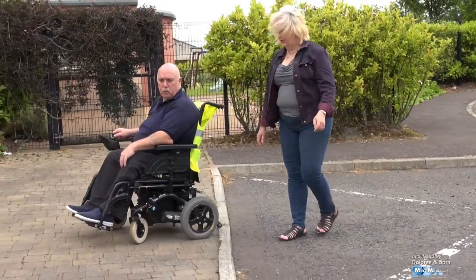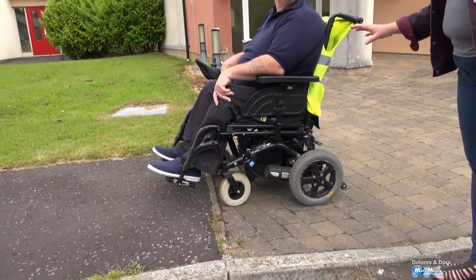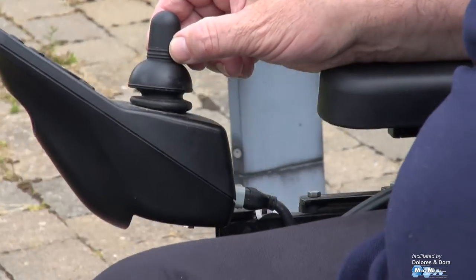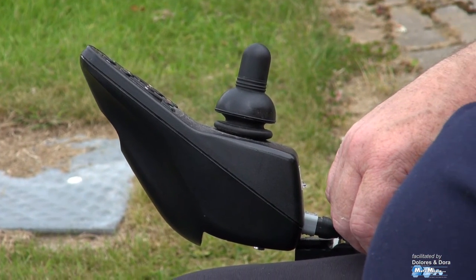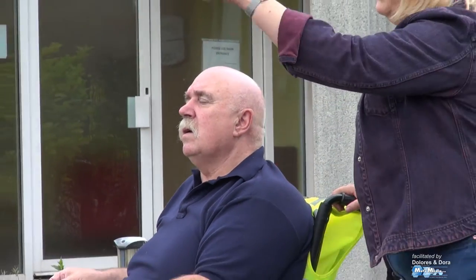Now turn left and stop on the slope here David. If you take your hand off the control, you will find that the chair stops because it has an electronic brake and you will not roll backwards on a slope — there's a slight click and it kicks in. The control release has allowed the electronic brake to click in. Did you hear that? Good. That means the chair will not roll backwards because your electronic brakes are on. So if you have to stop on a slope, you're always safe. You can proceed along the pavement now all the way to the end.